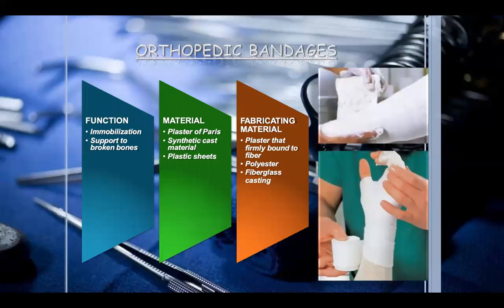Then orthopedic bandage. What is its function? The function is immobilization and support to broken bones. Materials like plaster of Paris, synthetic cast materials, plastic sheets and fabricating material can be used. It's a plaster firmly bound to fiber, maybe polyester or fiberglass. Nowadays, different varieties of orthopedic bandages are available, to ease the patient and to fix the fracture accordingly.